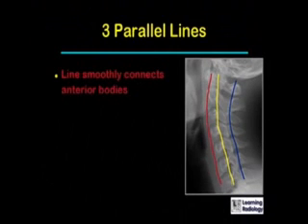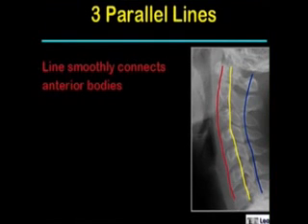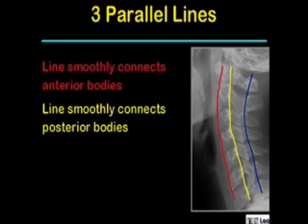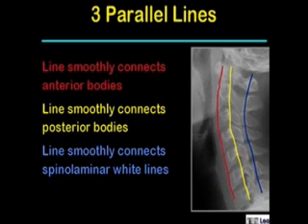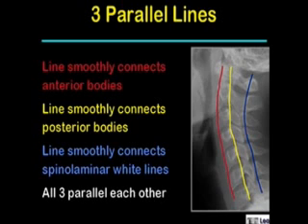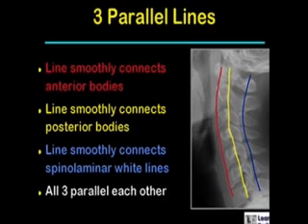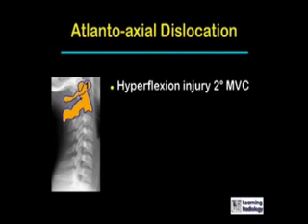Also important are the three parallel lines that you can imagine on every lateral view of the cervical spine. The red line should smoothly connect the anterior aspects of all of the vertebral bodies. The yellow line should smoothly connect the posterior aspects of all the vertebral bodies. The blue line should connect the junction between the spinous process and the lamina, called the spinal laminar white lines, in a smooth curve. All three of these lines should parallel each other smoothly.